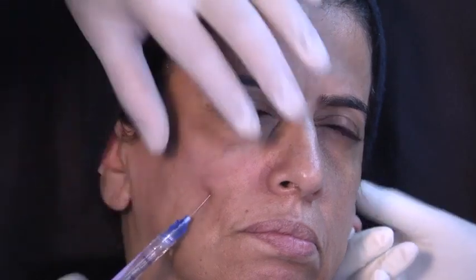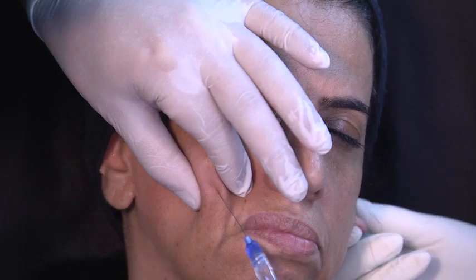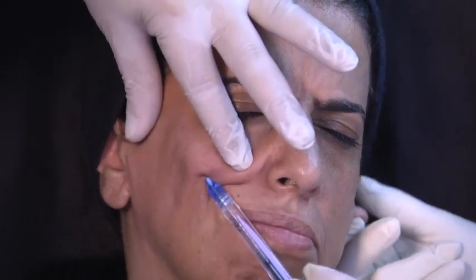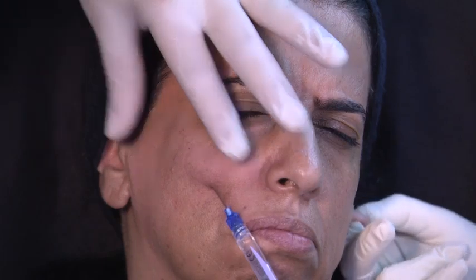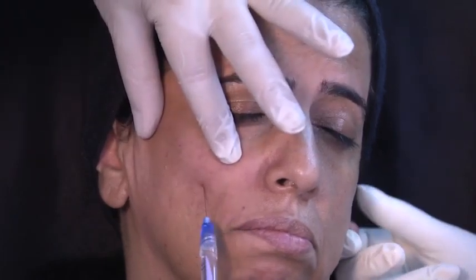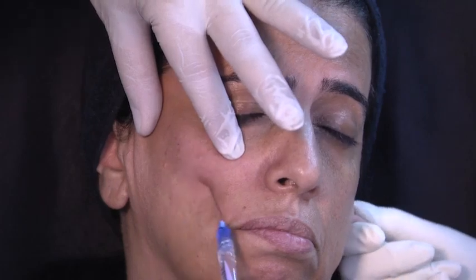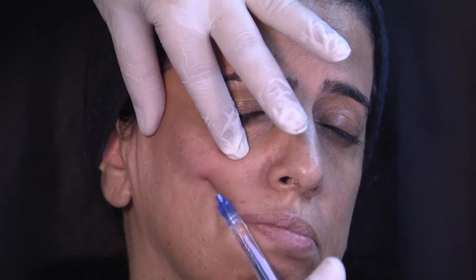And I think this is what we were talking about: having to understand the injection anatomy and the difference between superficial and deep fat pads and over bone injection. Right, and really personalizing the products to not just indication, platforms, and patient needs. Exactly. And I also can do a softer transition. We can try to go to the other side, to this side, to do a softer transition.